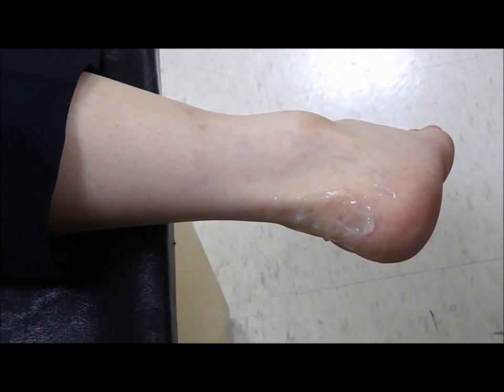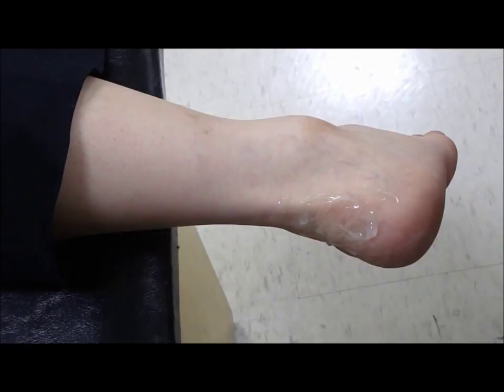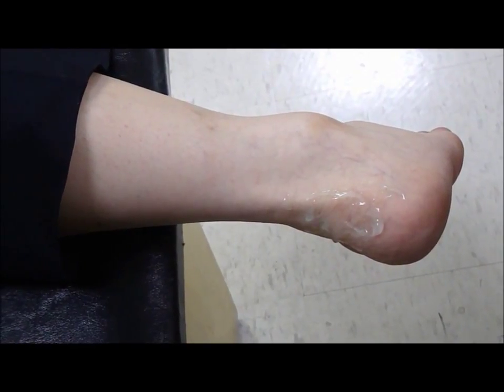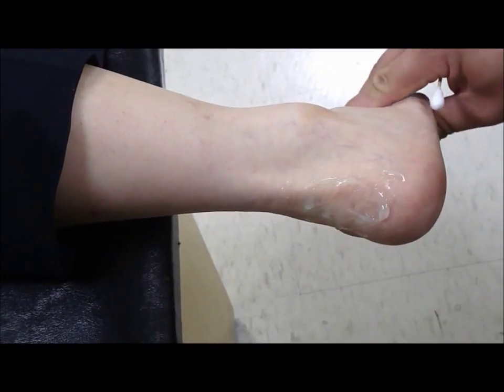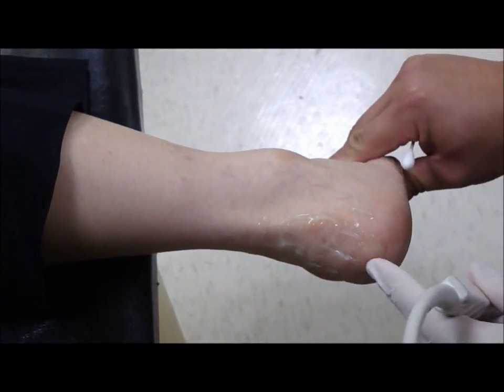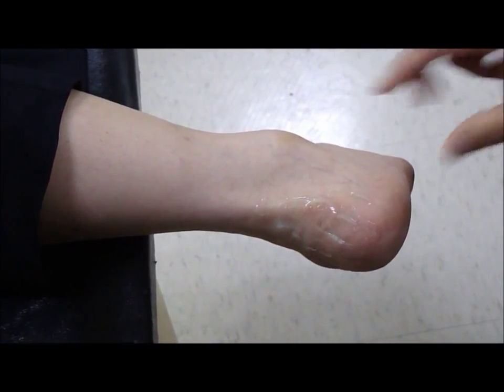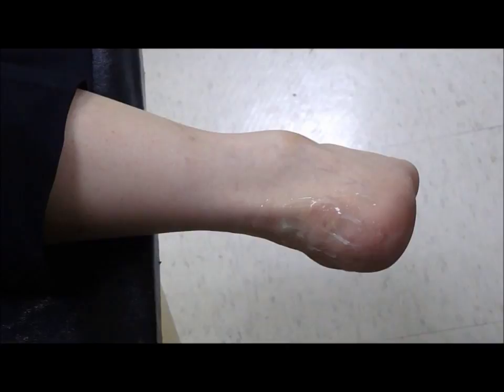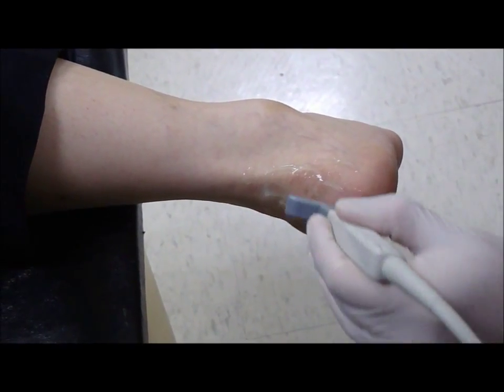During ultrasound examination of the posterior surface of the heel, the patient pursues the prone position, as you can see over here. This is the Achilles tendon. For the examination of the retrocalcaneal bursa, we put the probe over here.